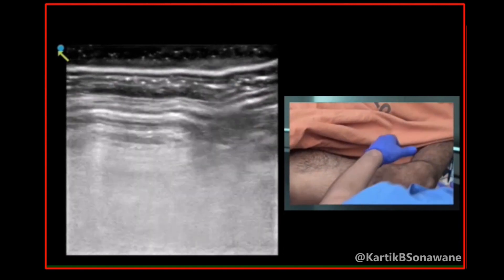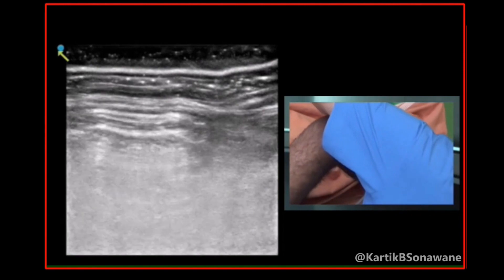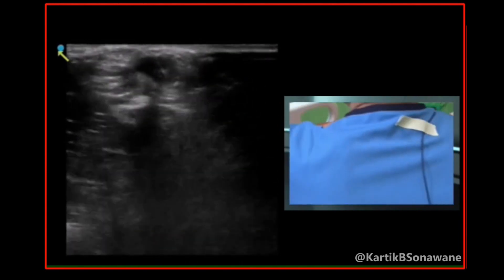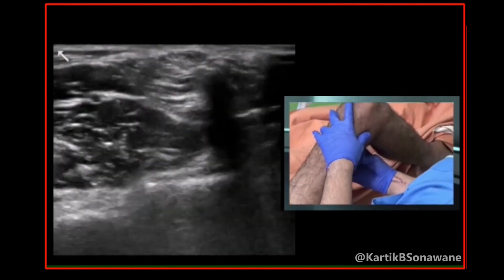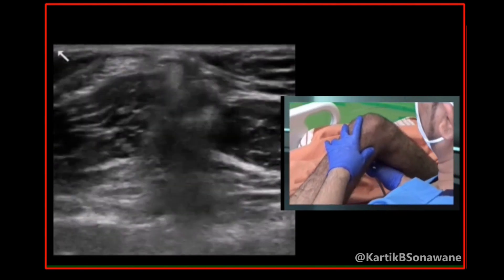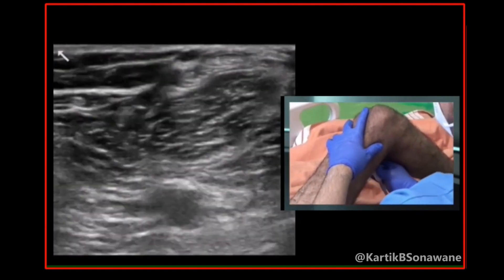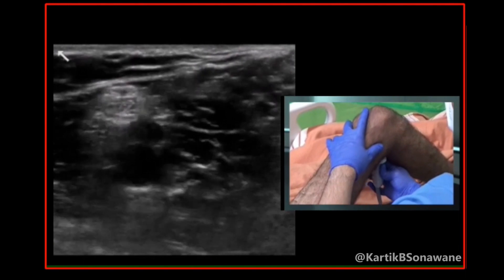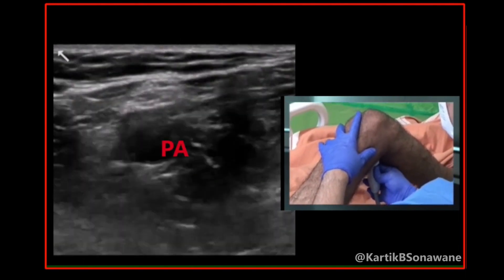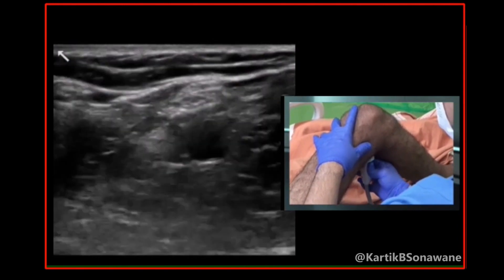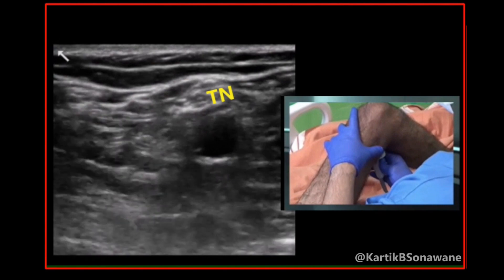The same injection can be given by putting the probe over the popliteal area. Ask the patient to flex the leg. Scanning over the popliteal region with the probe over the popliteal crease, identify the vessels. The popliteal artery appears as anechoic, with the vein just above it — demonstrating compressibility — and the tibial nerve just above the vein. This is the typical picture seen when giving a popliteal sciatic block.